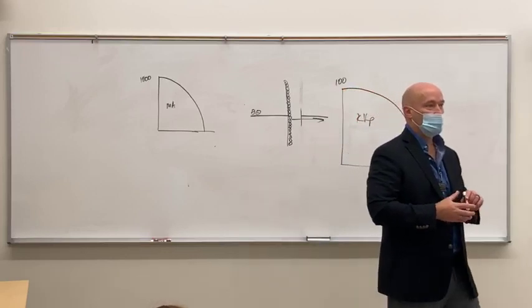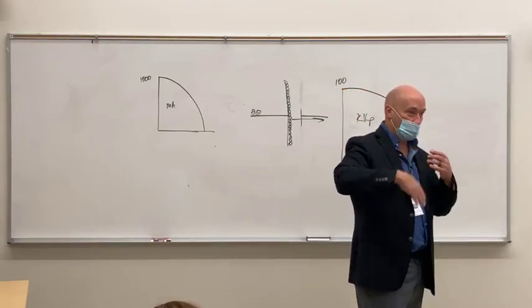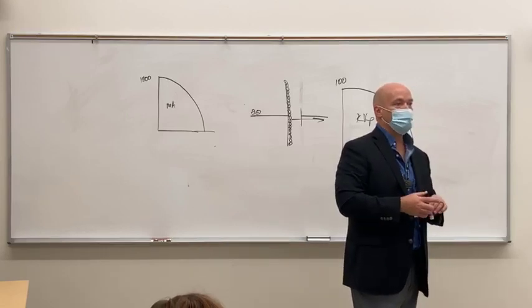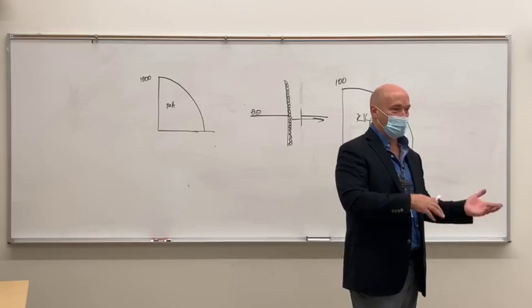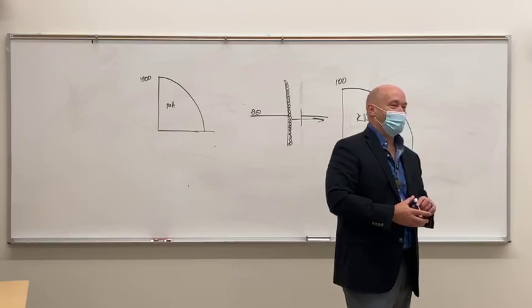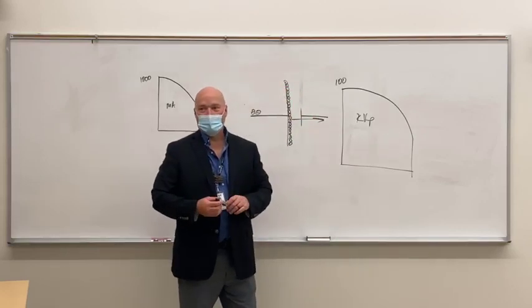And that has to deal with amperage. Yeah, the mA meter measures the actual amperage. But it's in the high voltage section working off low voltage. Because you've got to have both. Yeah. All right.